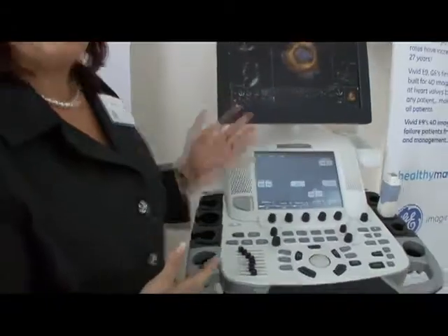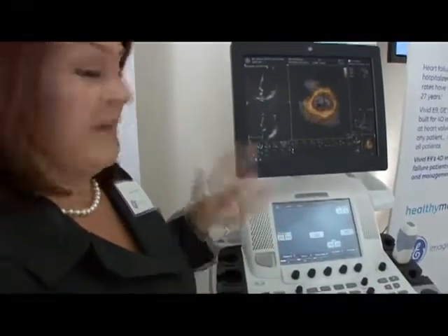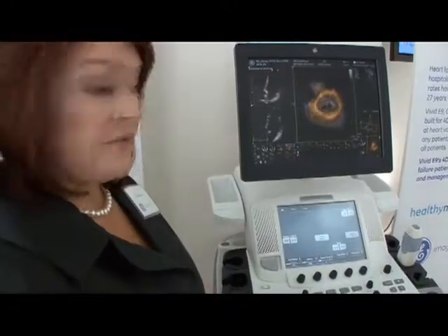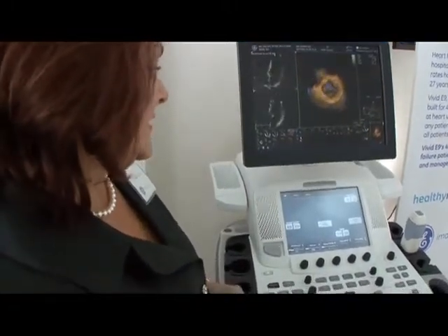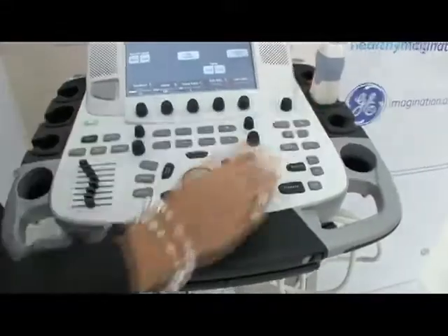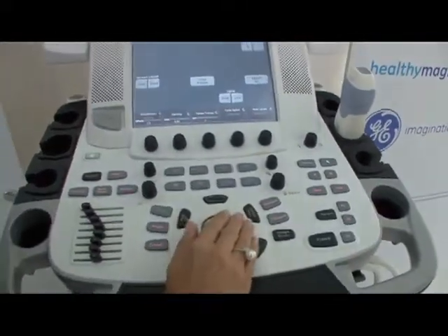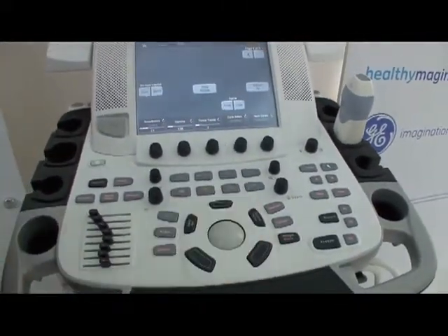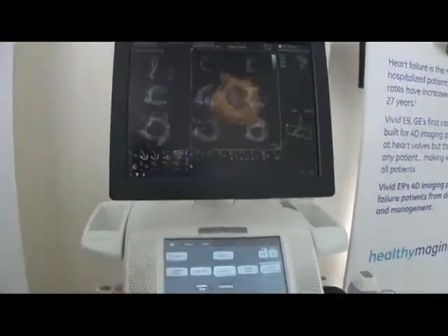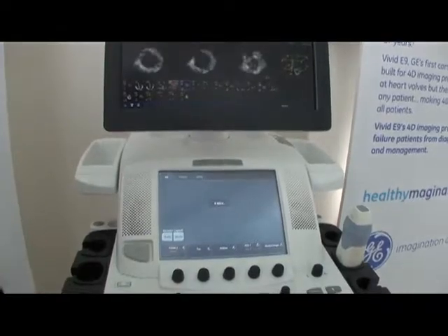We start off with a 4D image that's already been acquired and it's already been aligned. We have what's called Easy 4D views, so we basically take an image that's already been done and we can bring it up on the screen. Once it's up on the screen we have the ability to go to nine slice, which allows the physician to see nine equidistant slices.